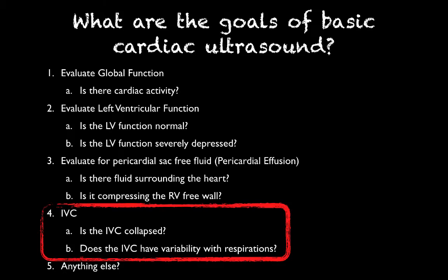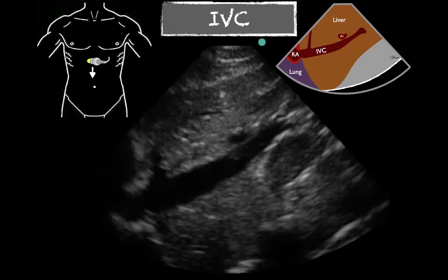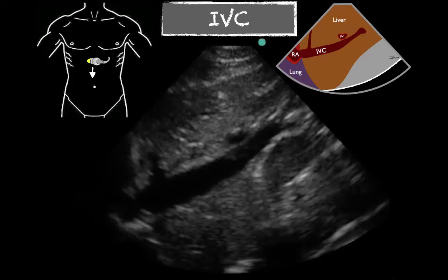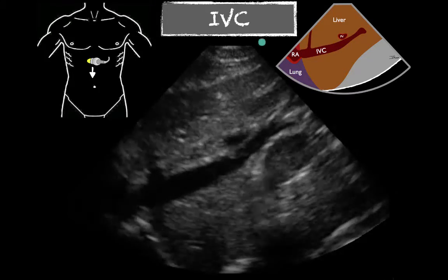Let's go ahead and start looking at IVC. Our first question is going to be: is the IVC collapsed? If the answer is no, then we're going to see does it have some variation with respirations. We'll see three examples here of just some respiratory variation.